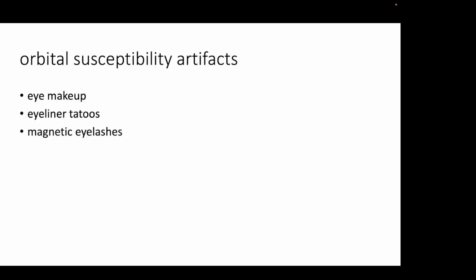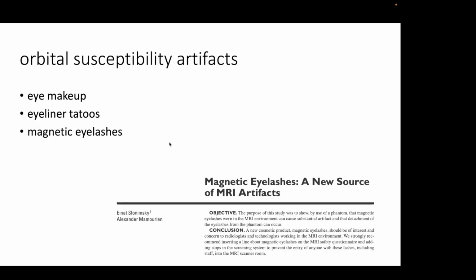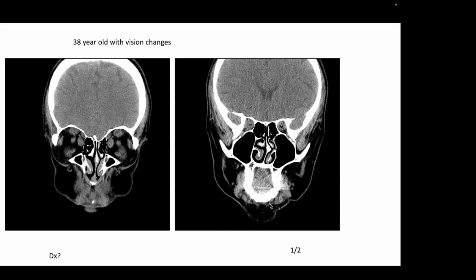Really? So they can be a problem as well. In fact, we did a paper about magnetic eyelashes. And oddly enough, of all the papers that I've written, this is the one I've gotten the most popular press interest. People would call me about this, and I think people love the idea of them flying off in the scanner. But in preparing patients, you want to make sure they take their eye makeup off, and if they have magnetic lashes, definitely take those off. All right.